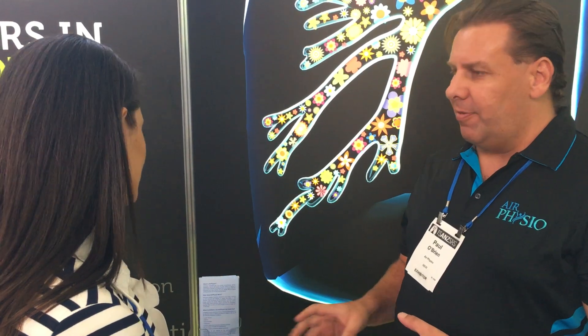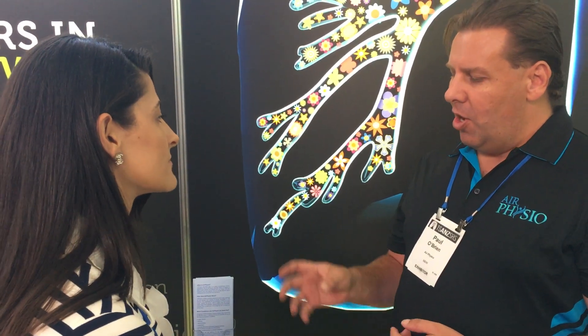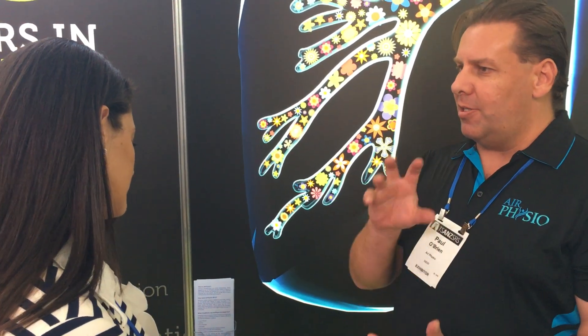This happens between 25 to 35 times per second, which gives you a vibration so that the airway walls are shaking, though the effect is limited to the actual airway walls.